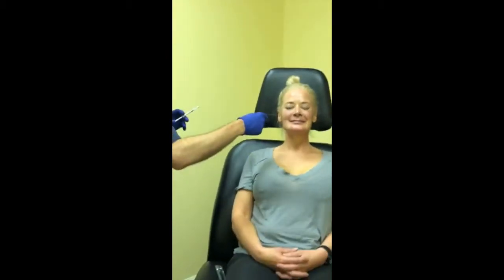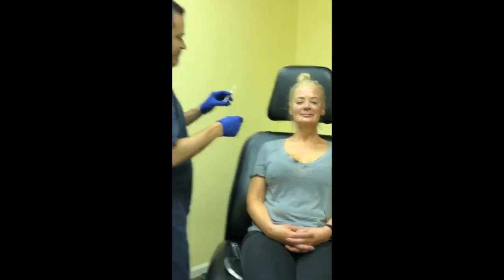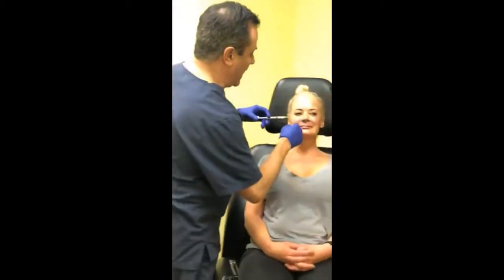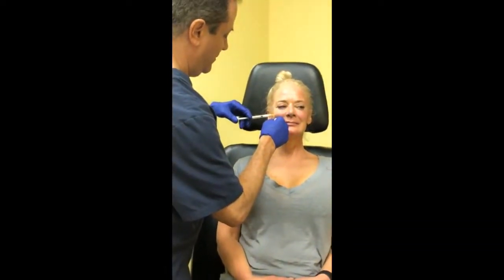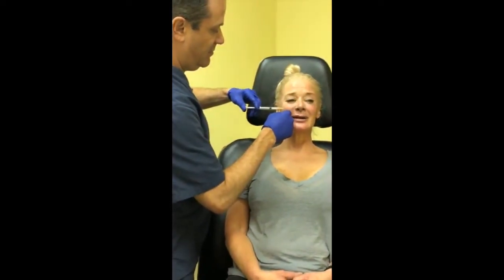We've gotten all of this correction and I've used just over half of the first syringe. That's it. Wow — that's crazy. And it doesn't hurt at all.